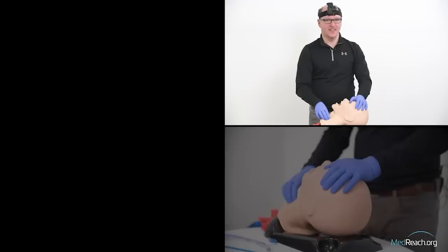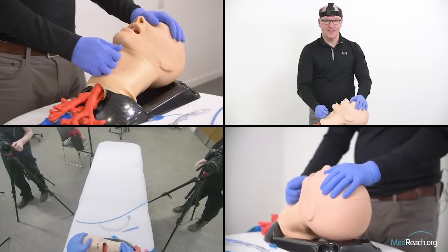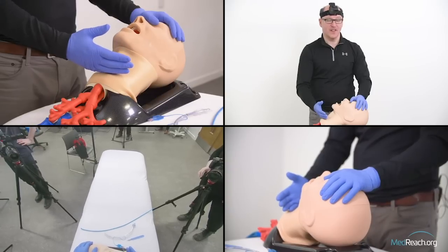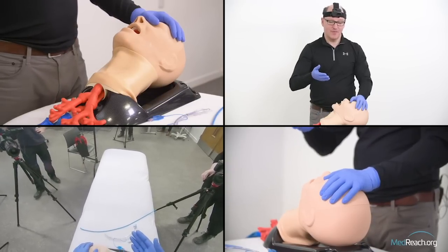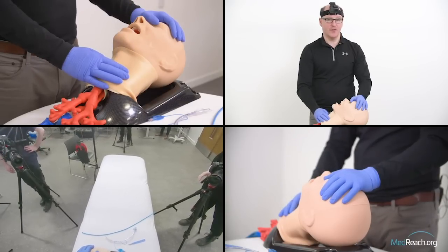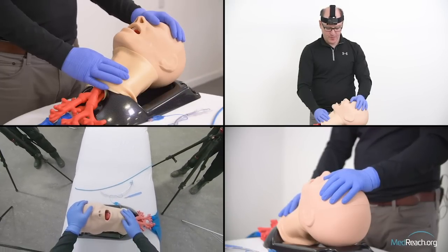We're going to do a surgical airway with this TruCor mannequin, emphasizing the critical points: the laryngeal handshake, external stabilization, making a vertical incision first, verifying the location, rotating around to horizontal, putting our finger in the hole after making the incision through the cricothyroid membrane, and then passing a bougie and tube into the airway.